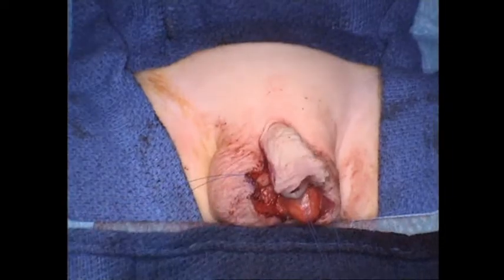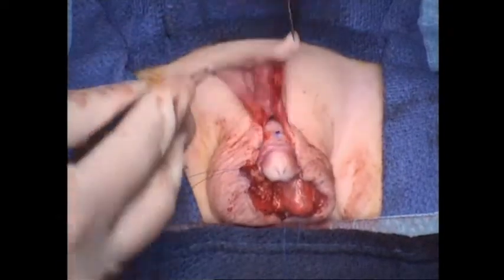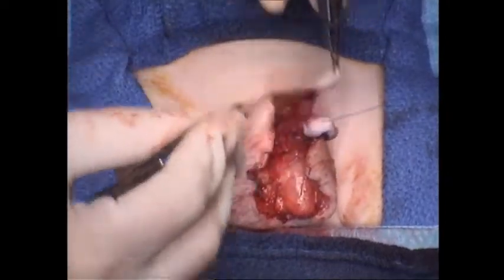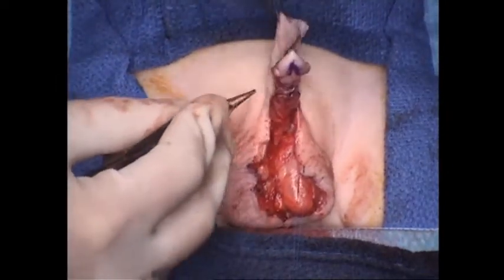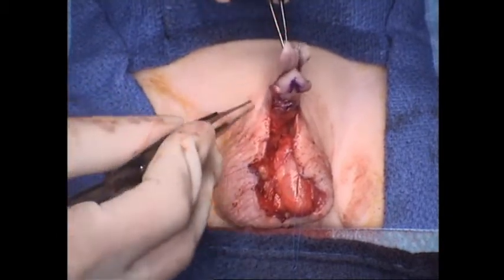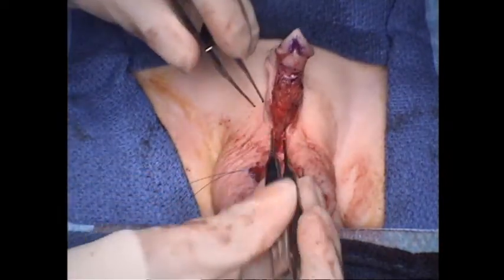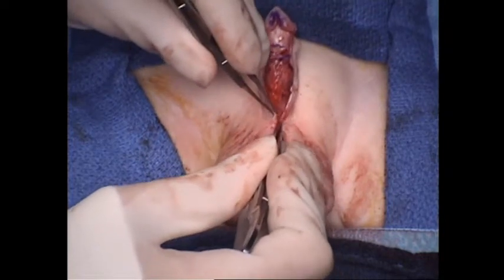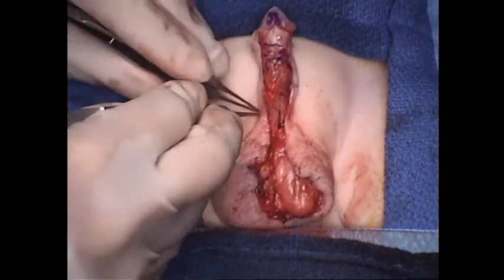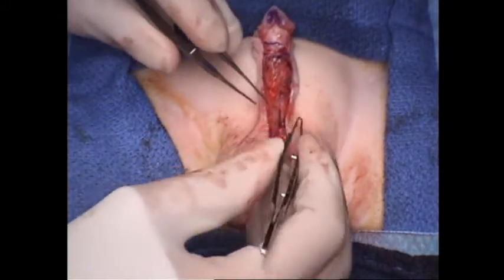Now, before we go to harvesting our graft, we don't want to do any of this to size any of our graft or our shaft skin while we're just so loose like this, because it's very easy to foreshorten your ventral skin by accidentally pulling up too high here. Okay, so we want to fix some points, and we're going to do that by fixing the penoscrotal junction at the 3 and 9 o'clock positions with the PDS to make sure that we have a long enough amount of shaft skin along the ventral surface.